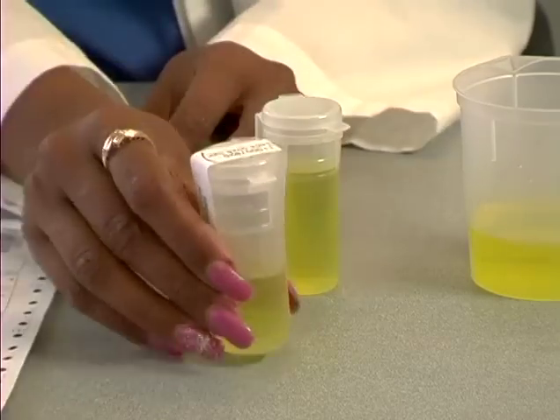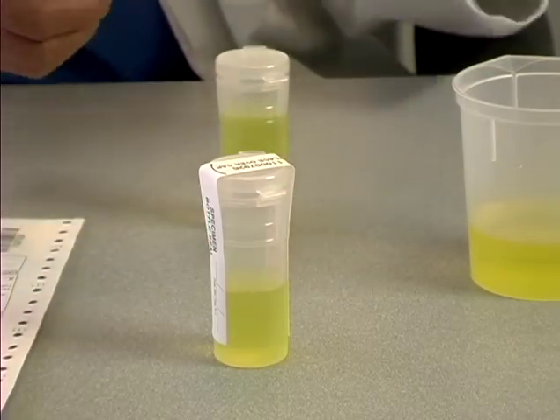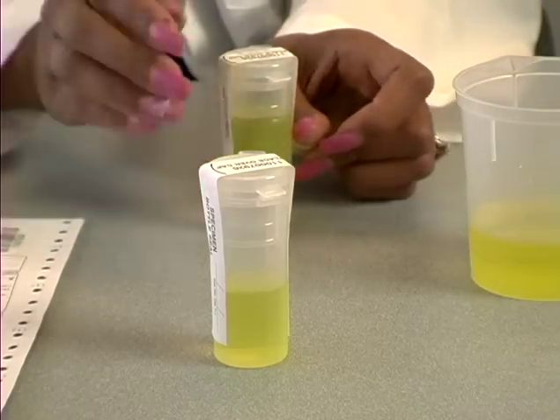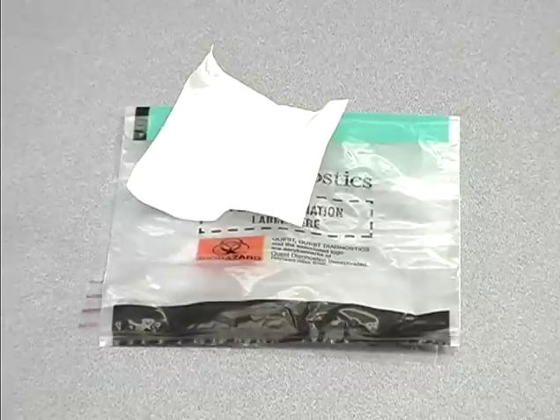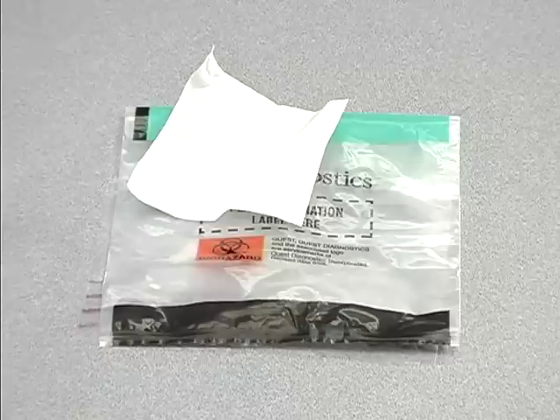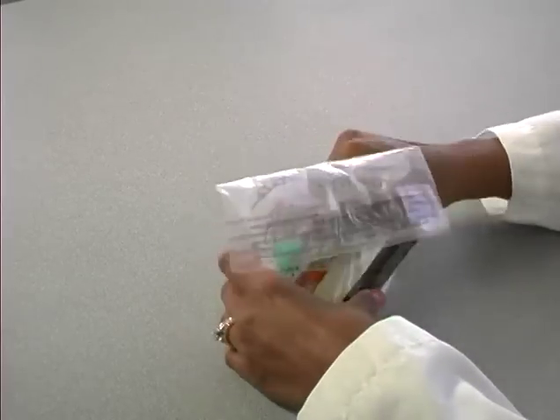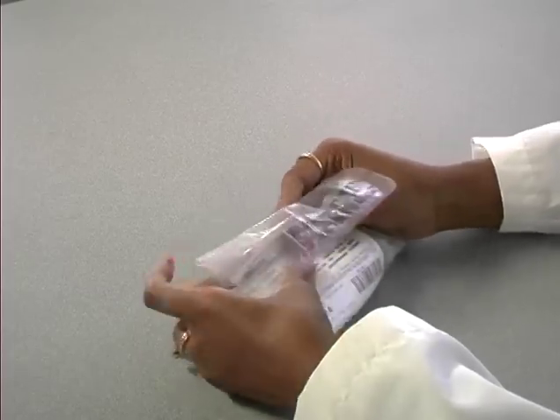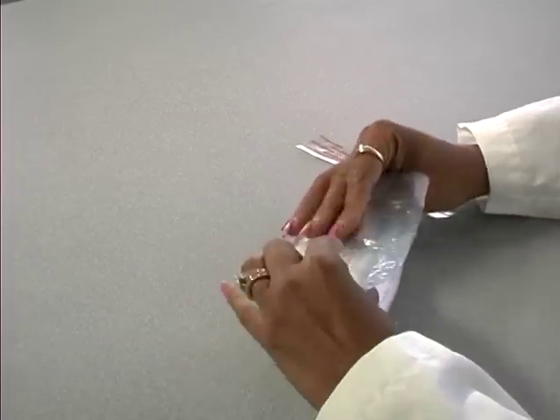The seals must fit on the bottles so that they won't be damaged when the collector dates and the donor initials the seals. The bottle should also be designed so that overlapping seals do not conceal information. All DOT specimens and accompanying CCFs must be transported to the laboratory in sealed leak-resistant plastic bags. Each bag must have a tamper-evident sealing system and 2 sealable compartments or pouches that are leak-resistant. One compartment is for the 2 specimen bottles and the other is for the CCF.